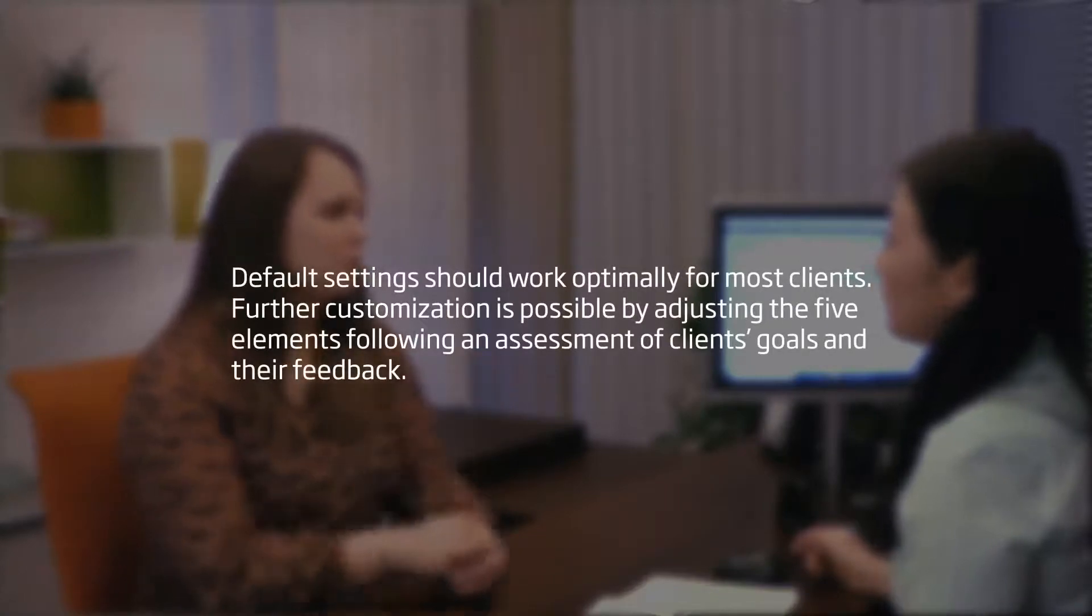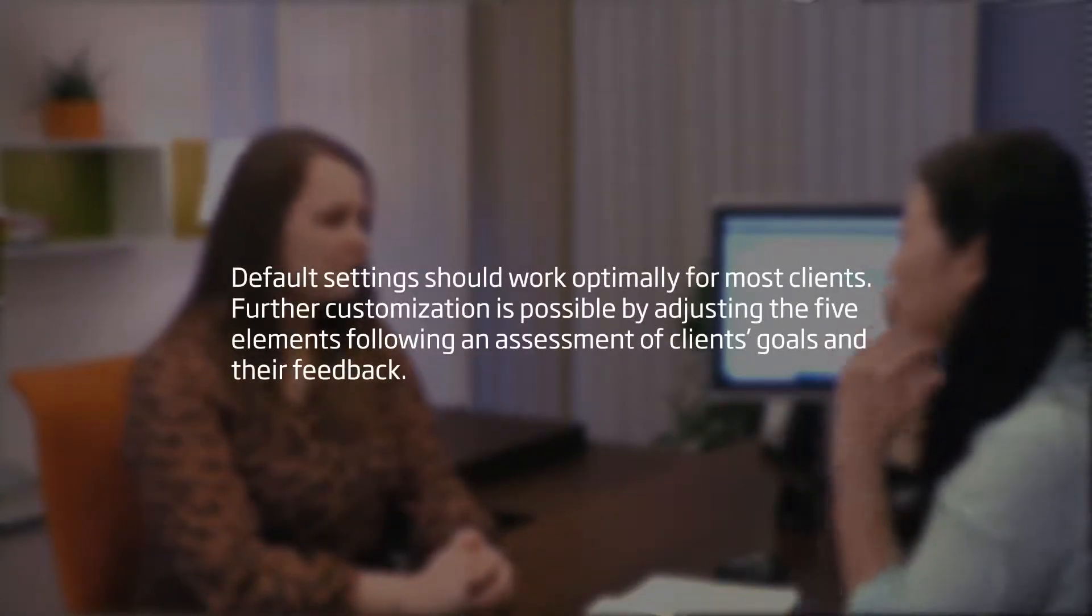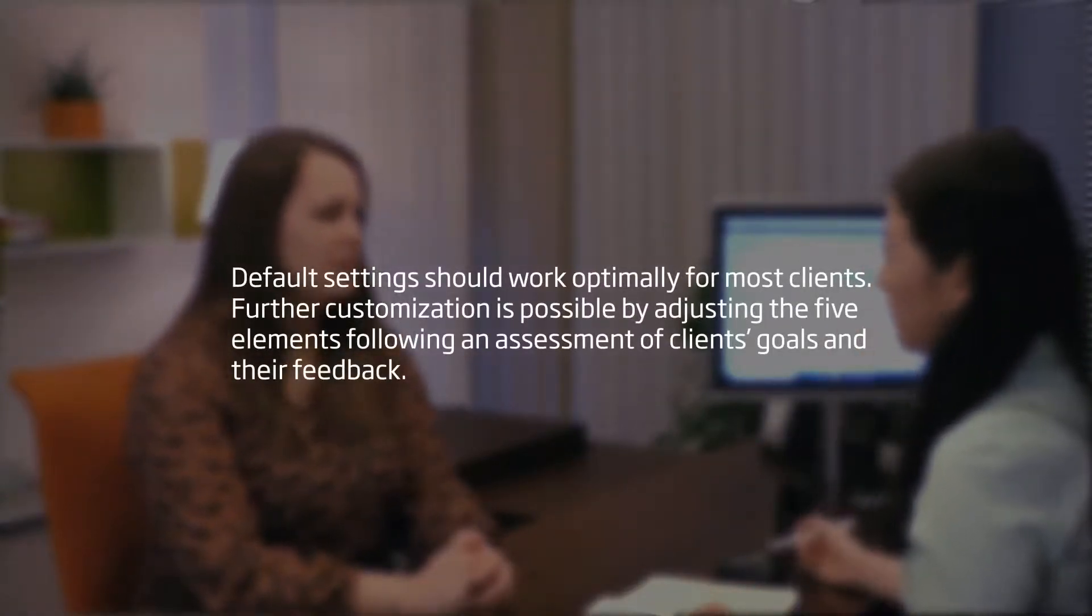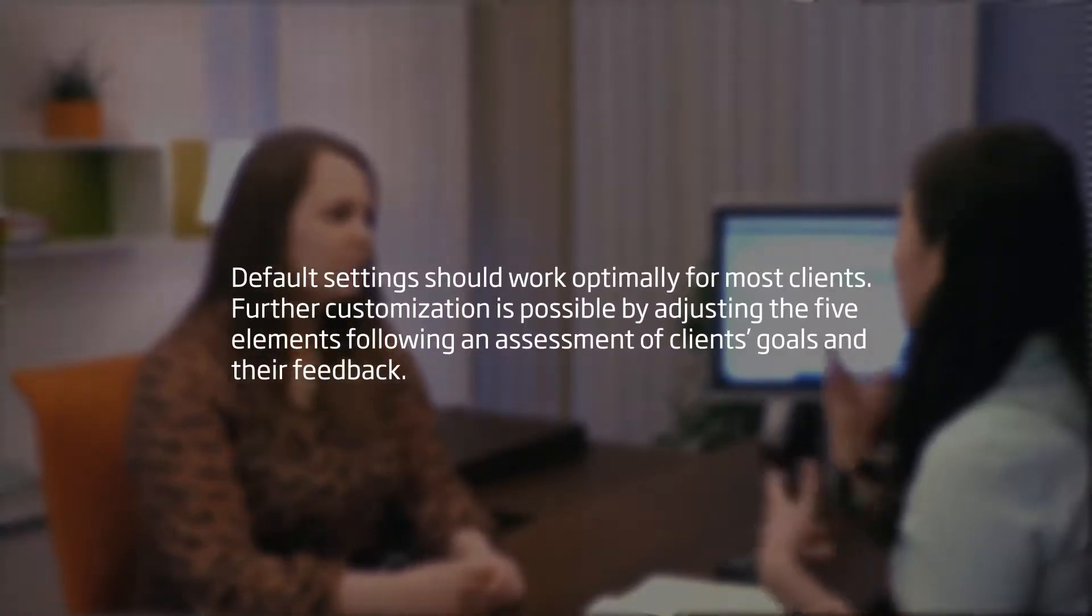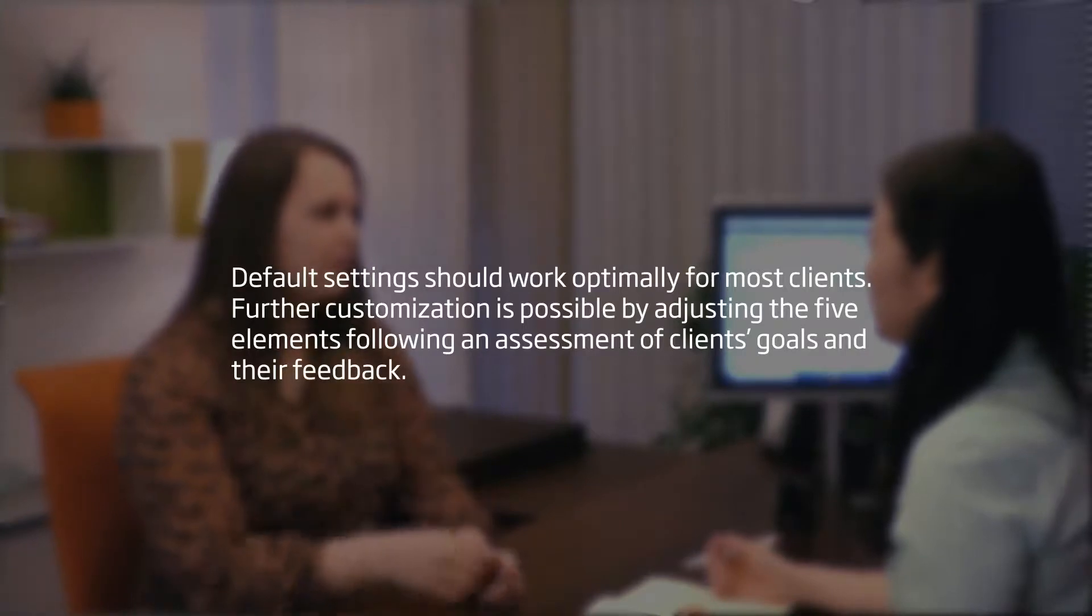Here we have seen an example of how More Sound Intelligence could help hearing care professionals personalize hearing experience for different users. The default settings that More Sound Intelligence prescribes would work optimally for the user. For cases where the user may require further adjustments, there are many ways to find a solution to ensure an optimal fitting for the user.